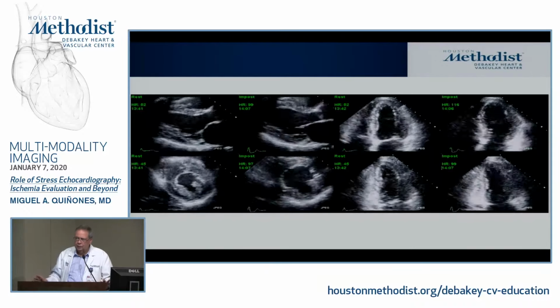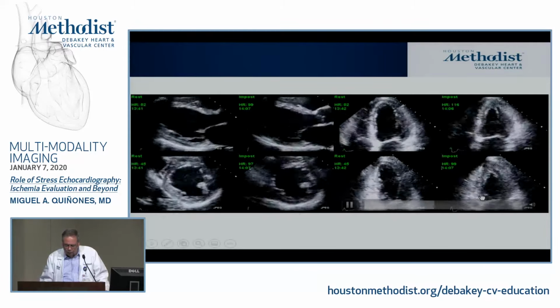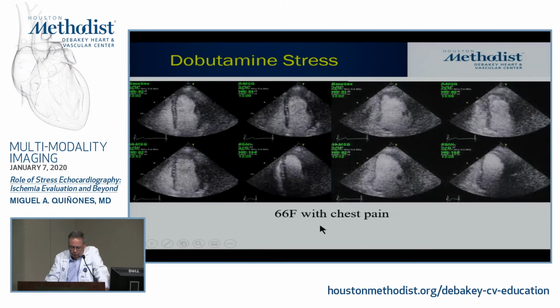Dr. Sabia and I do it all the time. There are times when we scratch our head. And this is one of those segments. The inferior base, I think, is the most problematic for all of them.